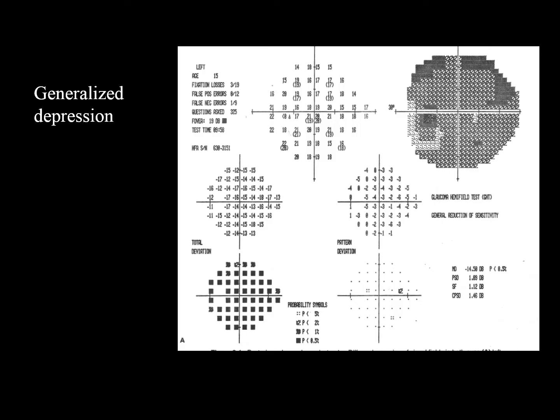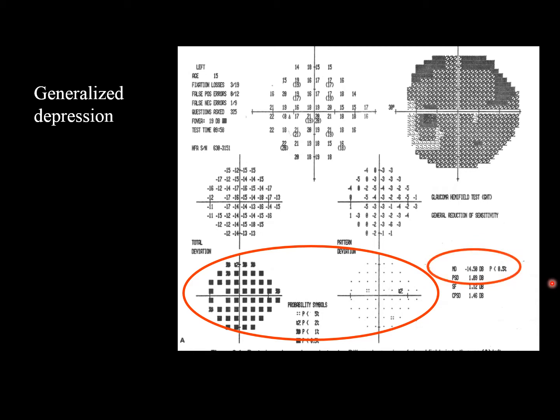This is an example of generalized depression where you see changes in the total deviation but nothing is seen in the pattern deviation. If you check the mean deviation here it is minus 14, so this is severe generalized depression. Notice also that the foveal threshold is reduced — normally it is around 30-32, but here it is 19.